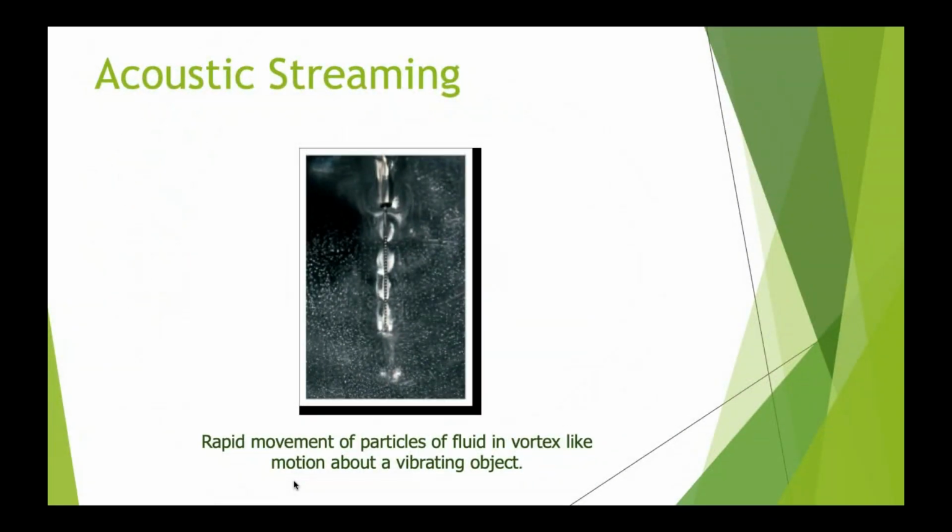But if you look at it clinically, what you're really looking at is an ultrasonic tip in the middle, and then you can see the sound waves and the waves of the solution in and around that whole needle, and you can see how it disperses laterally, in all directions. So therefore you get a much more rapid movement of the particles itself. And so that helps to clean the inside of the canal quite a bit. And it's controversial in the sense that some clinicians will think it is not as useful and others will think it's the best thing ever.